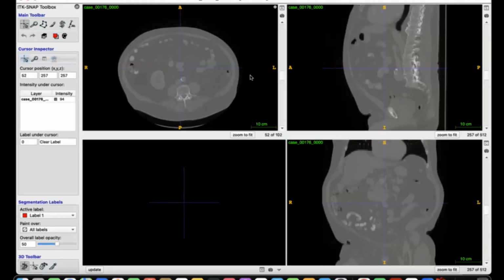Back on the table? Yes. So the answer is back on the table. Here you can see this is the table, and we have this spinal cord here. We have this spinal column, a protective layer of bones, so it will show as bright on the CT scan. So we can see this is the back.